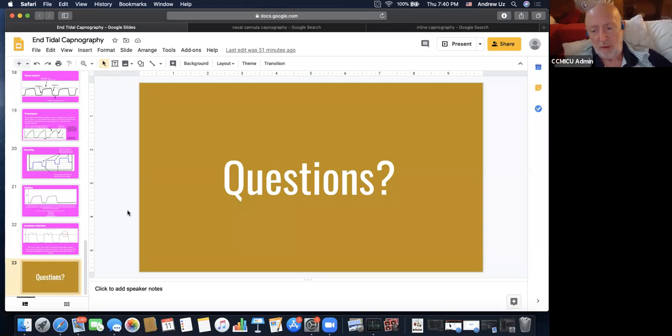Now, can you use it in intubation? No, because intubation itself isn't a BLS skill. But is end-tidal CO2? Yeah, sure.